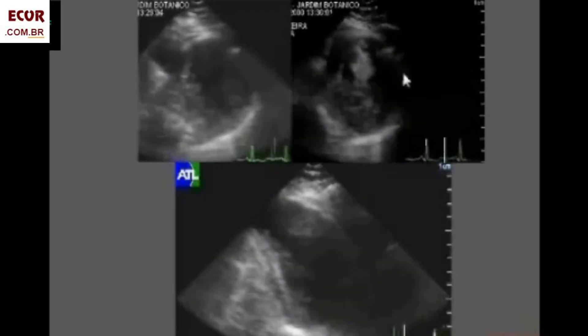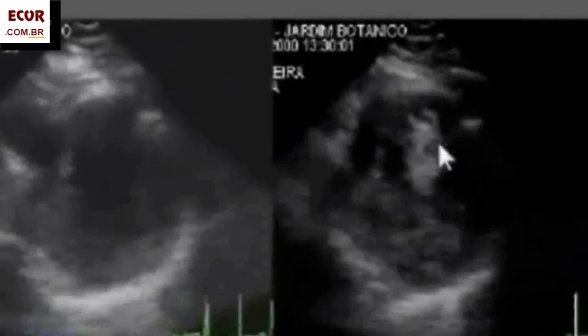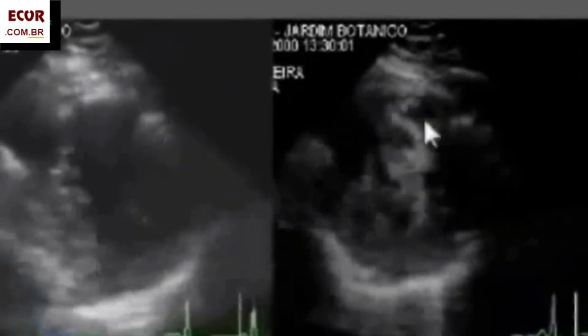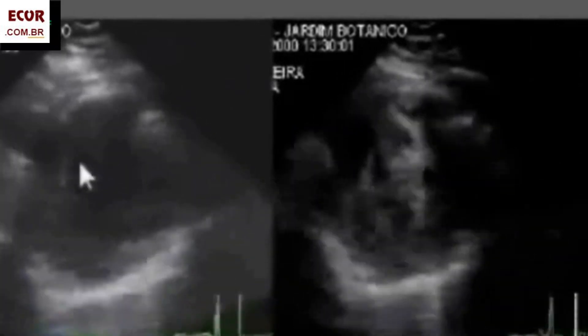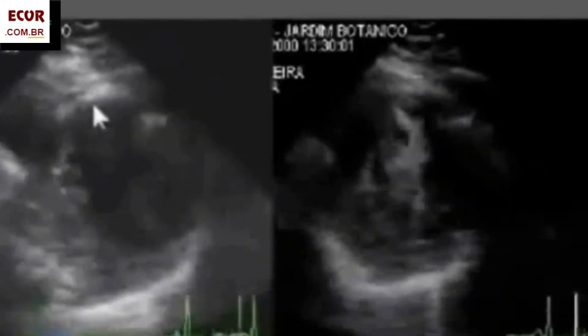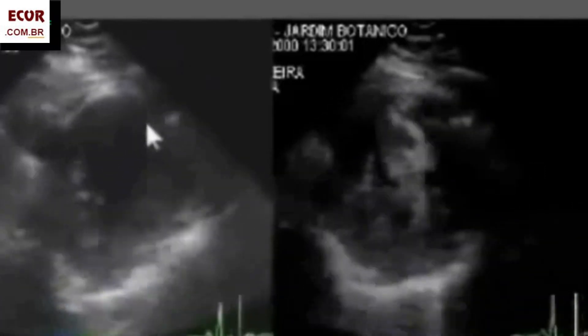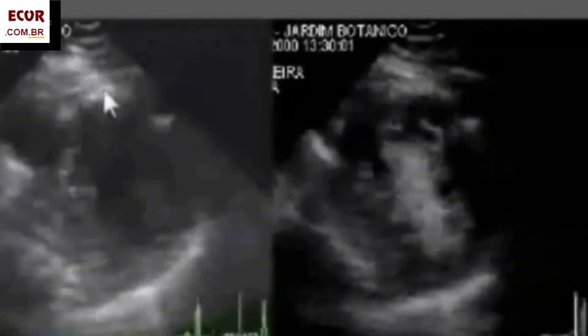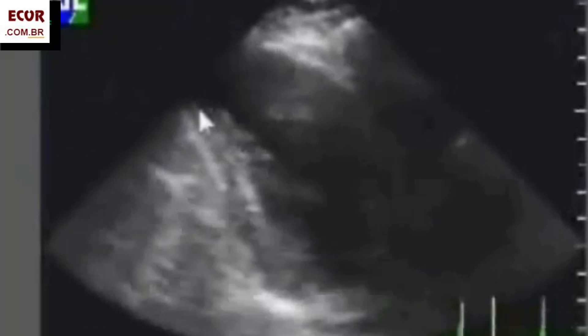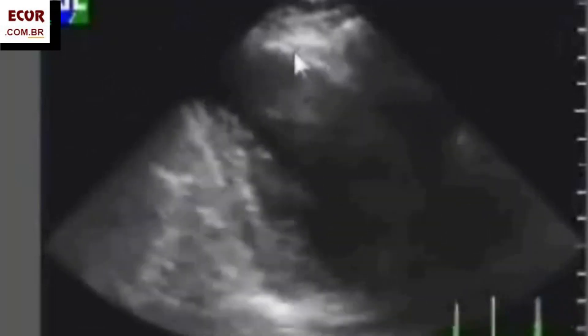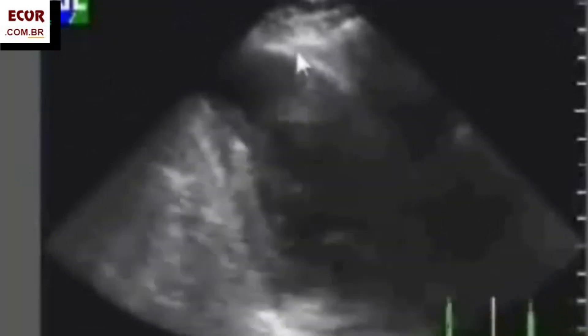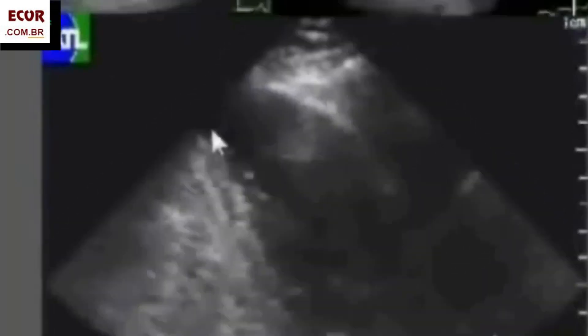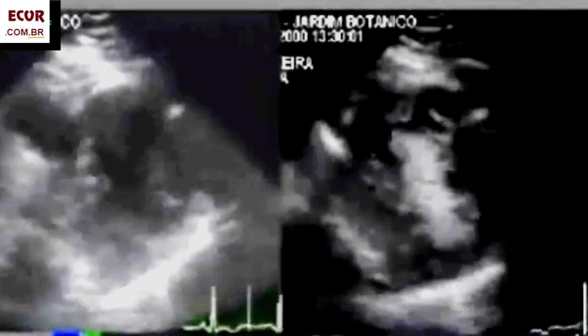Another case — there is microbubble contrast here so you can better see the endocardium. You can see the septum — the anteroseptum and the anterior wall. It's fibrotic, it is really dyskinetic, so it seems to be an aneurysm. In this long axis view, we see the beginning of the neck here and all the fibrosis of the anterior septum, characterizing the aneurysm of the anteroseptal apical wall.